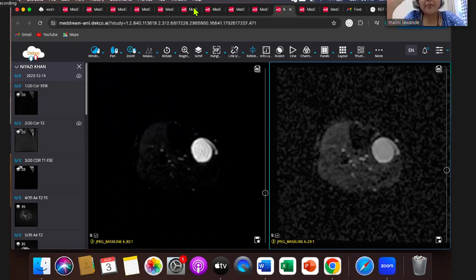The role of MR is more important to tell the extent, and in such cases, it's fine to put it as indeterminate and ask for a biopsy rather than label it as benign and then later it turning out malignant. Because soft tissue tumors do not follow the rules like in bone lesions. You can have a very well-defined lesion which could be malignant.